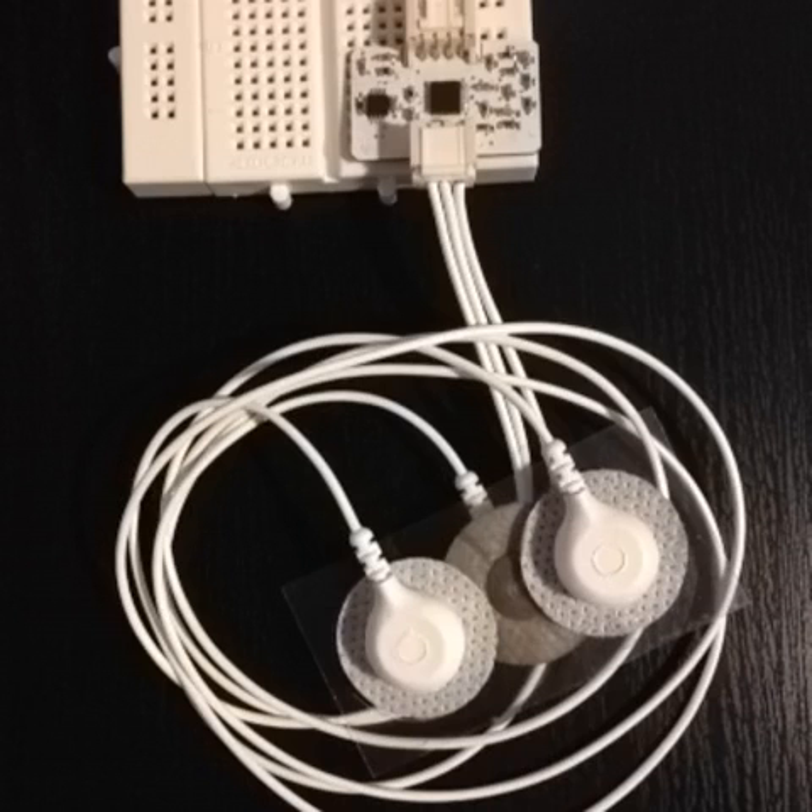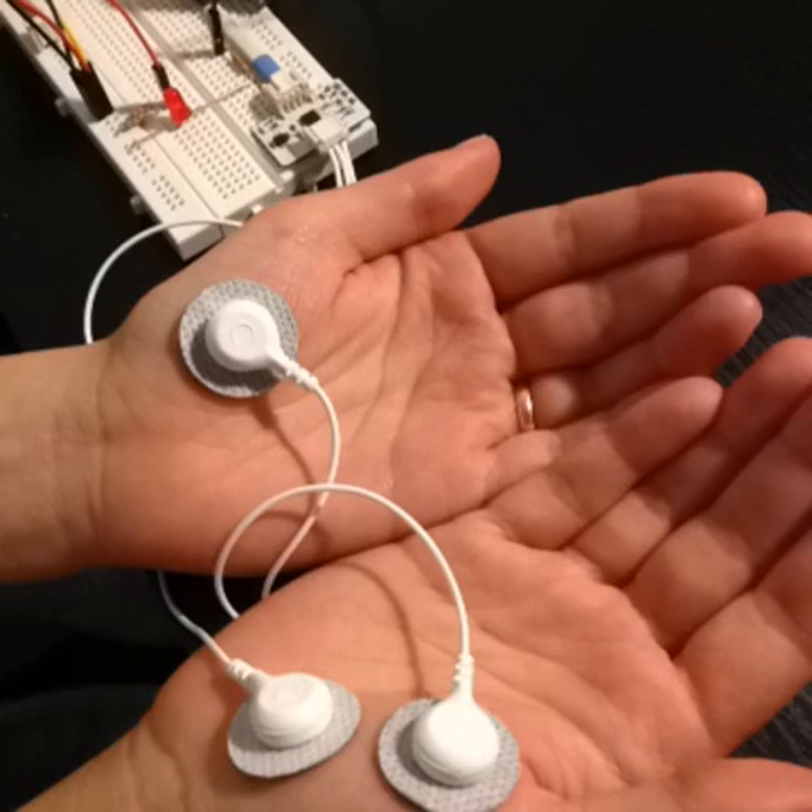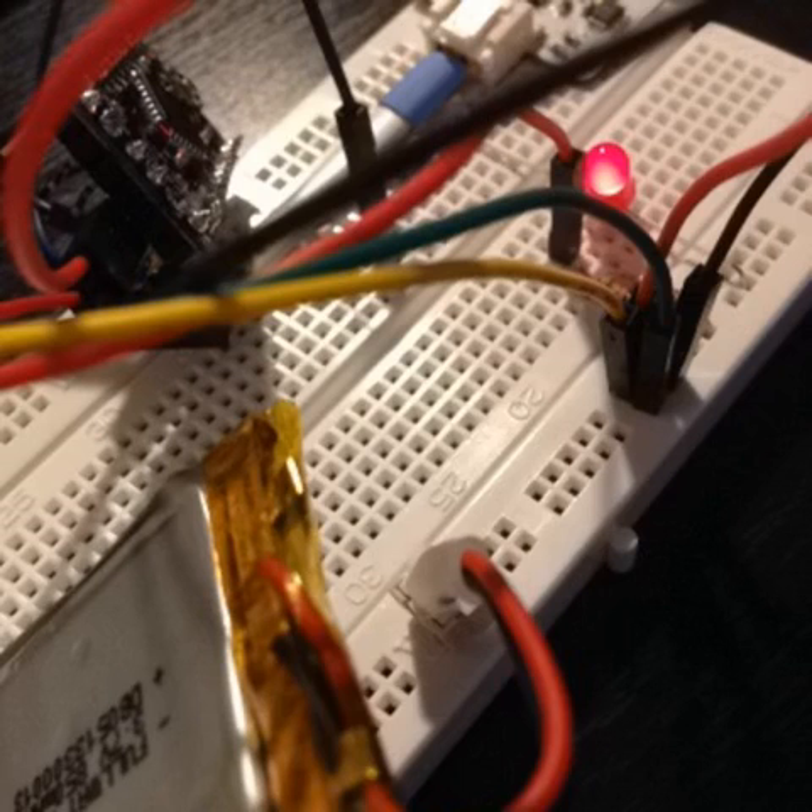Hook up the ECG sensor to your circuit and use the 3-lead accessory snapped onto the electrodes. Then connect the electrodes to your body — in this case we're using the minus electrode on the left hand and the plus and ground on the right hand. And that's it! Your LED should be blinking to your heartbeat. Visit www.vitalino.com for more information.